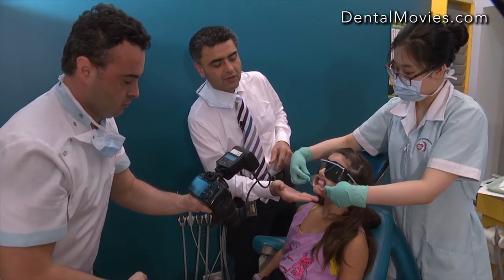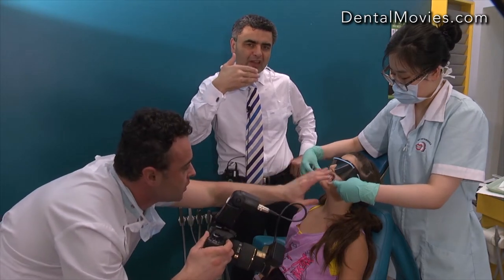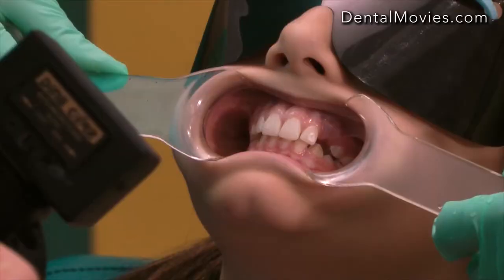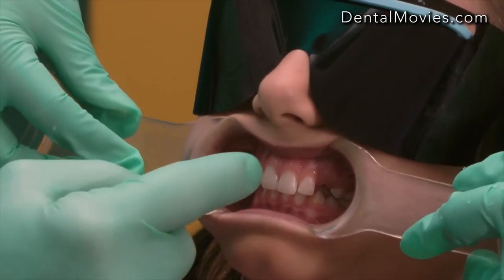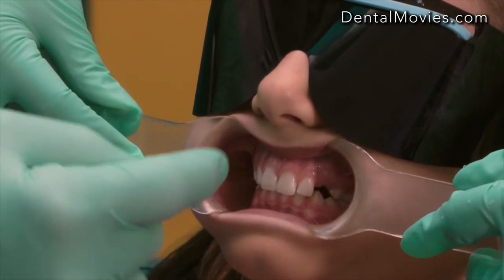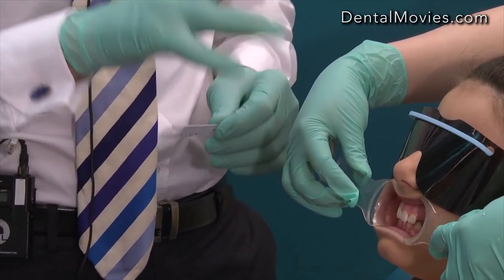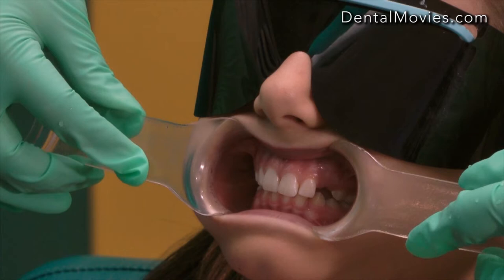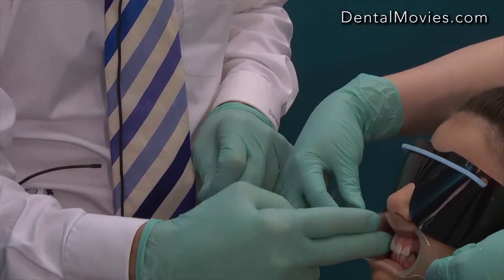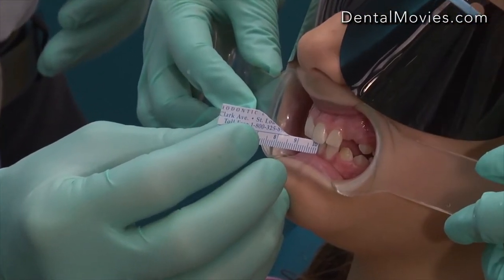We do a second shot which is the overbite or overjet shot. If there's a big overjet, I like to put a ruler in the mouth and photograph from the side. In this particular case, we have a Division 2 and a deep bite. For increased overjet, an enlarged labial frenum, a fractured tooth, or a fused or germinated tooth, I'd take a one-to-one photograph just of that area. For documenting an increased overjet, we use black cardboard behind the teeth to highlight them and place a ruler to get a measurement — these are additional photos beyond the standard six intra-oral and six extra-oral.